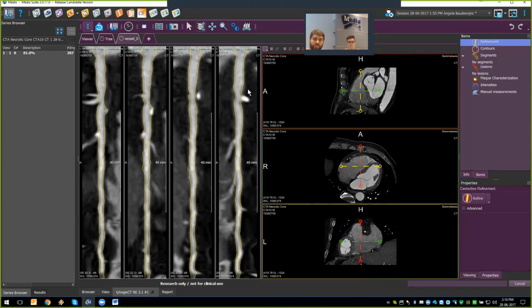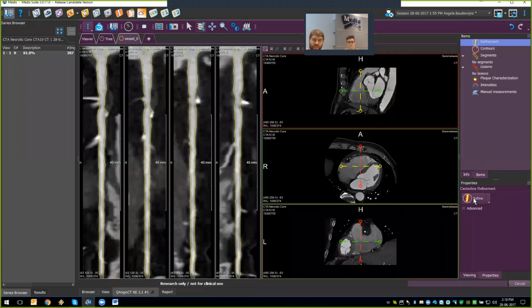manner of the vessel. And these are just an initial estimate of the luminal borders and the luminal center. We can do some automated refinement to try to further straighten this out from the initial positions. And this usually greatly improves the detection and delineation of the lumen.